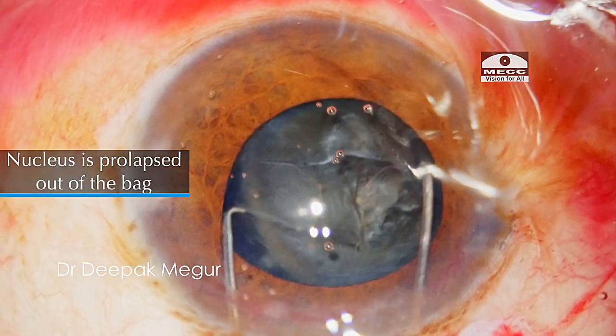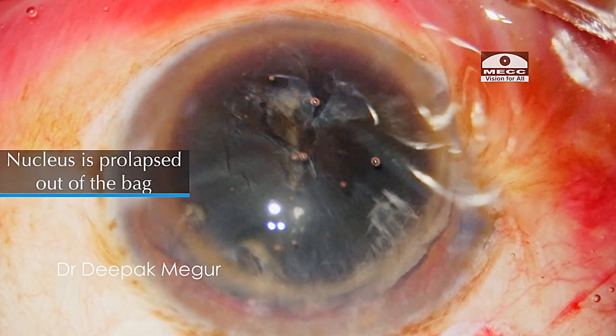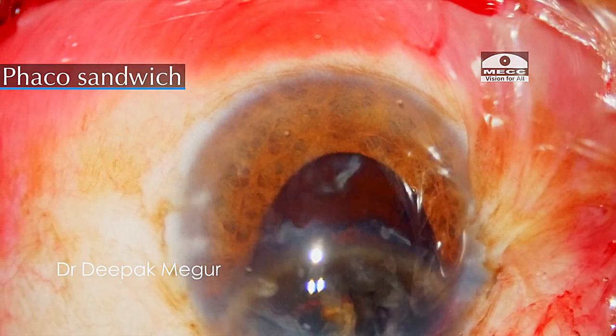In this case, the nucleus is being prolapsed out of the bag bimanually using two Sinski hooks. Then, under the cover of viscoelastic, it's being extracted out of the anterior chamber using the phaco sandwich technique.